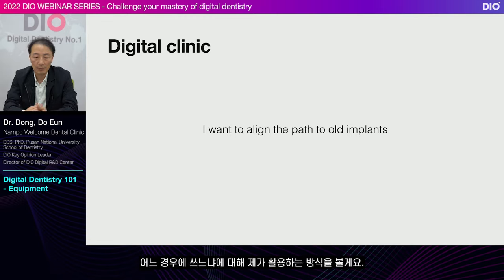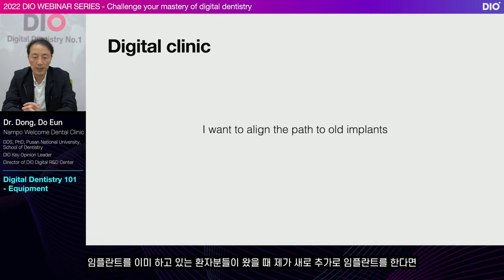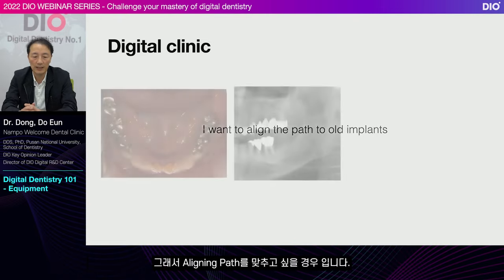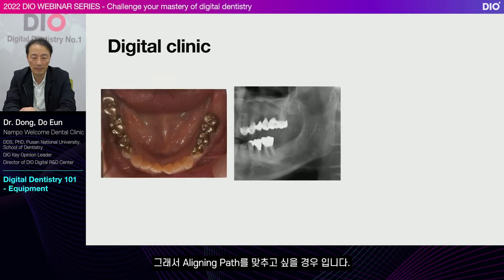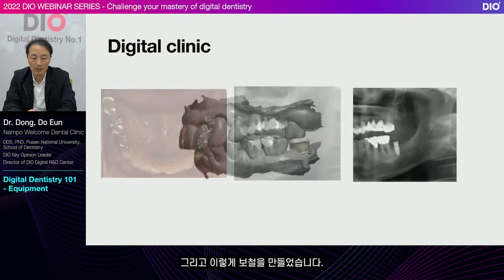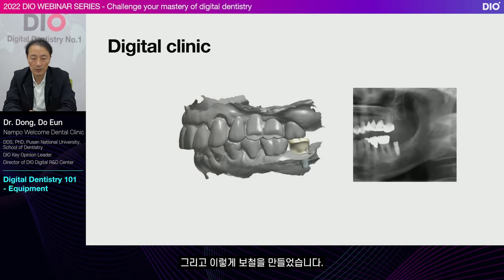I'll talk about how and when I use it. If a patient who already has an implant comes and I want to place a new additional implant, it will be nice to make the two together. So you will want to match the aligning path. This patient got a prosthesis in the 40s. I placed one. And I made the prosthesis like this.